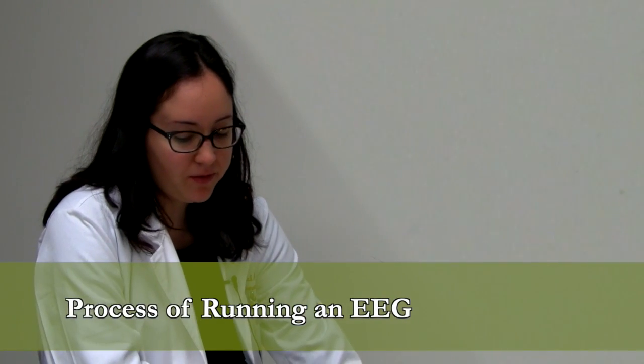I think it would help to sort of go through a typical acquisition process step by step for EEG to explain the parameters that you can manipulate to obtain the desired information in a reading. So first, we set up recording software to apply certain filters and clarify data.